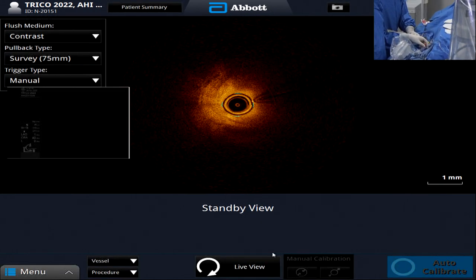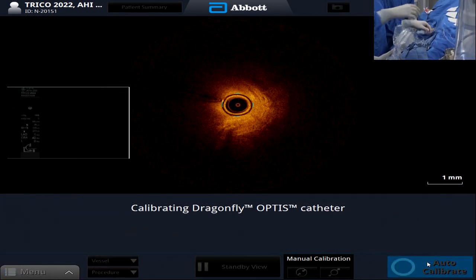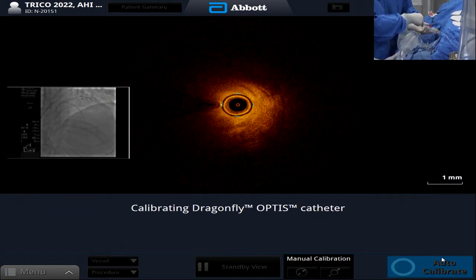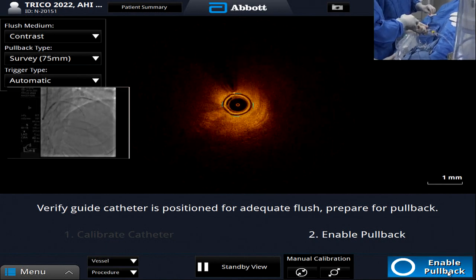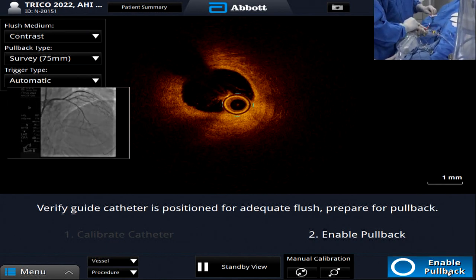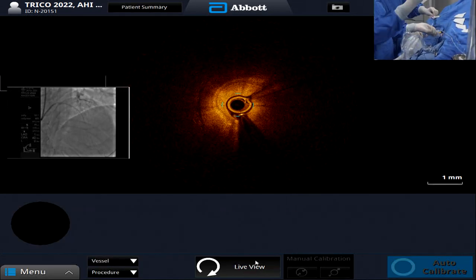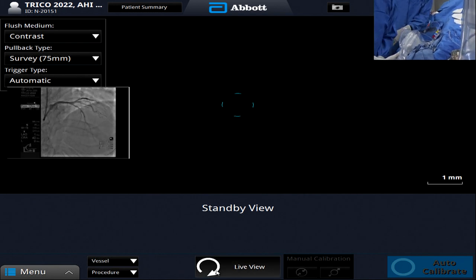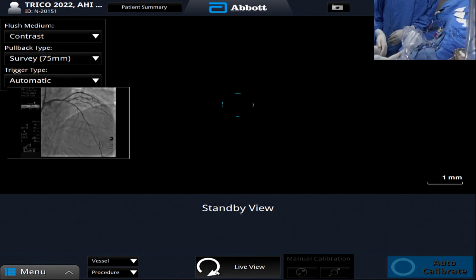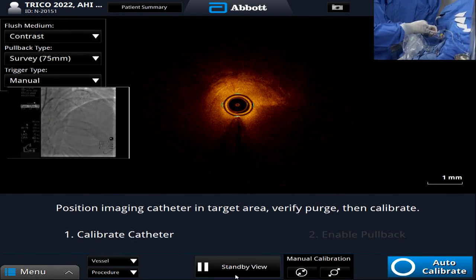And maybe for the panel, to educate me, are there area cutoffs? We live in a dichotomous world, so I don't really like the term cutoff, but when you're comparing OCT left main with IVUS left main, do you have any general principles for what you would consider significant by OCT? Yeah. I like to use an extension catheter because it's quite easy. We never miss obtaining the image.